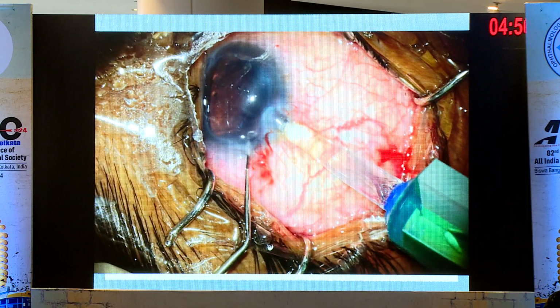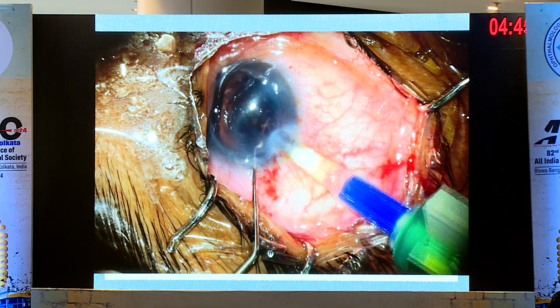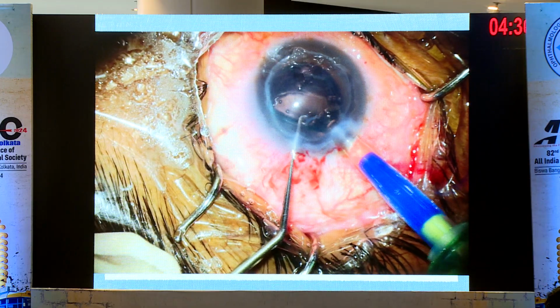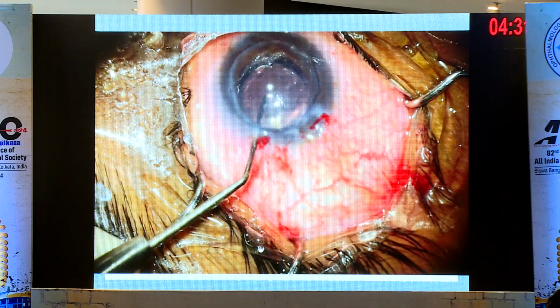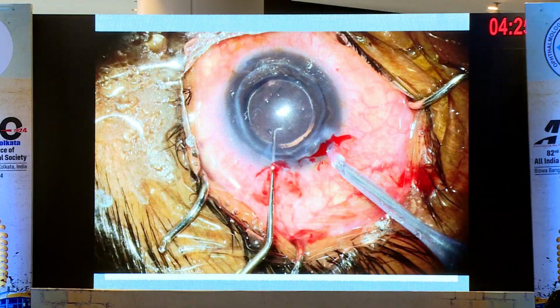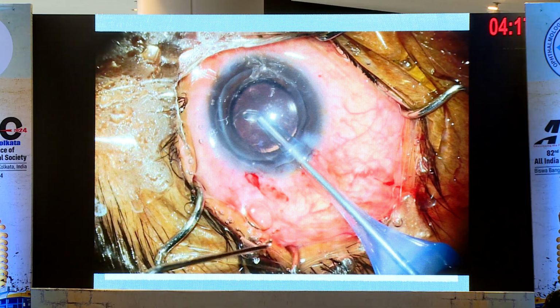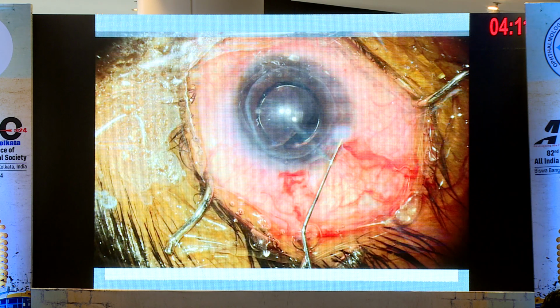Intraocular lens: keep in mind that if this patient is likely to require another DSEK or a DMEK in the future, you probably want to avoid a hydrophilic acrylic lens. In this particular instance, I'm actually using a hydrophilic lens, but in general, it's a good idea to go for a hydrophobic or non-hydrophilic lens, because hydrophilic acrylic lenses, when they come in prolonged contact with air, tend to calcify. Often this calcification is bang in the center of the optic, and that will affect the vision of the patient, and sometimes you have to change the lens. So it's really an exercise in futility, and you are probably best off using a hydrophobic lens.